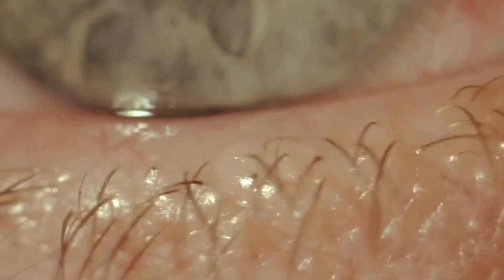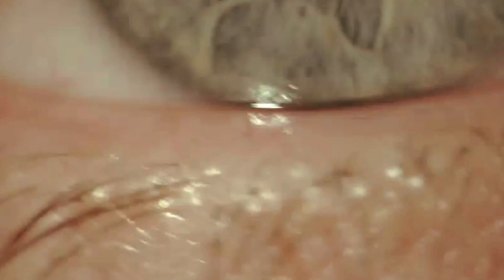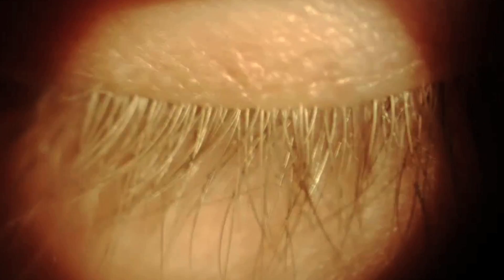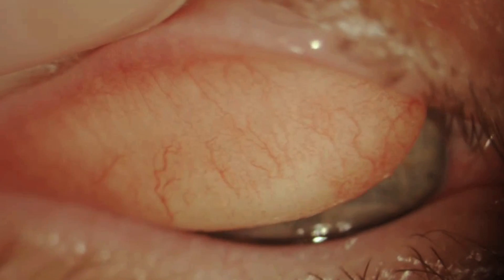Let's take a look behind the slit lamp. You want to be on the lookout for anything that might cause trouble with contact lens wear. Watch out for bad blepharitis and treat it if you find it, since that has the potential to cause serious complications. Look out for any redness and figure out why it's happening before putting a lens on a hot eye. Flip the lids and make sure they don't have any raging papillae — you can save yourself a lot of grief by preemptively putting them on an allergy drop. Finally, look at that cornea, as it can tell you a lot about the patient's previous lens wear habits. Neovascularization, scars, or infiltrates tell you that this patient may not have been compliant with their lens wear in the past.